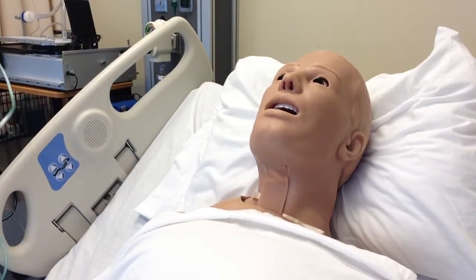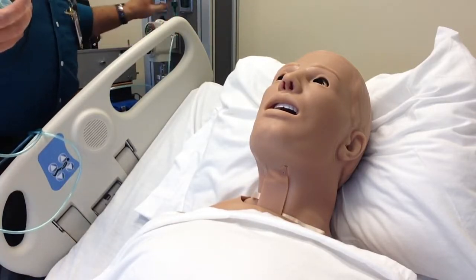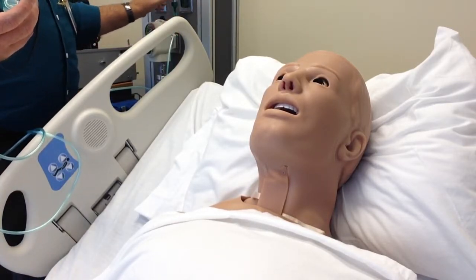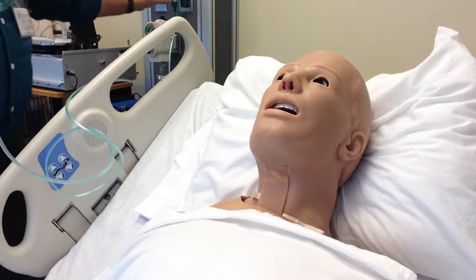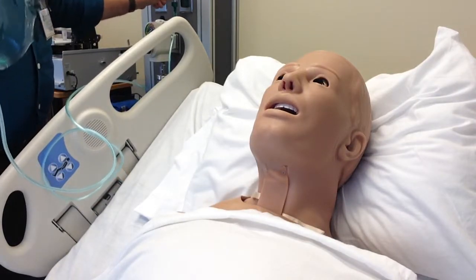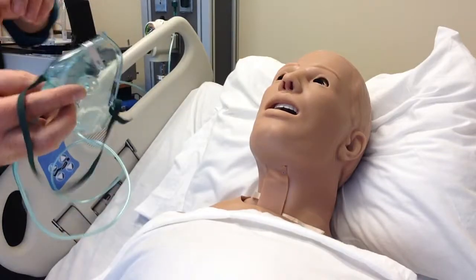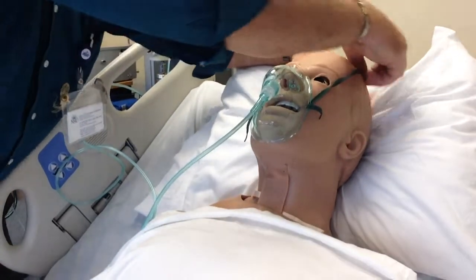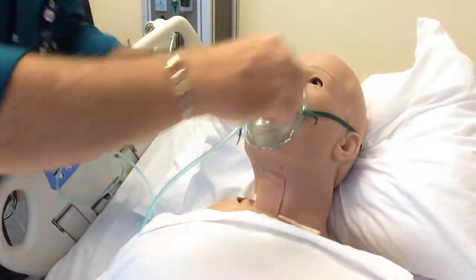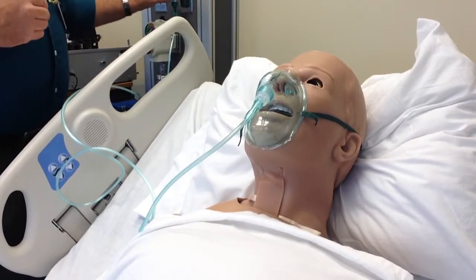Typically how you'd put this on: I explain the process to the patient, I connect it to my flow meter first and turn on my flow meter — that is running at 6. I then turn it to 12. I then tell the patient I'm going to put an oxygen mask on you. I have it flowing before I put it on the patient. This patient is now receiving 12 liters per minute via simple mask.